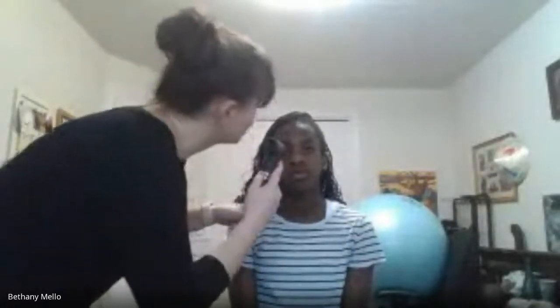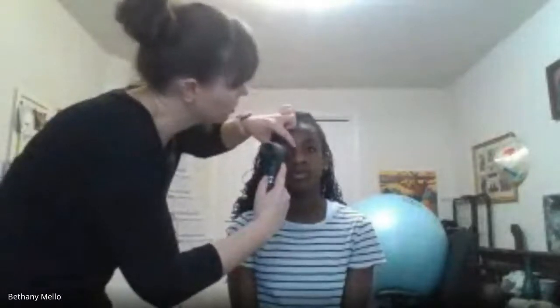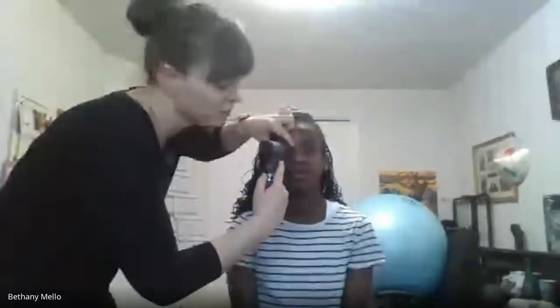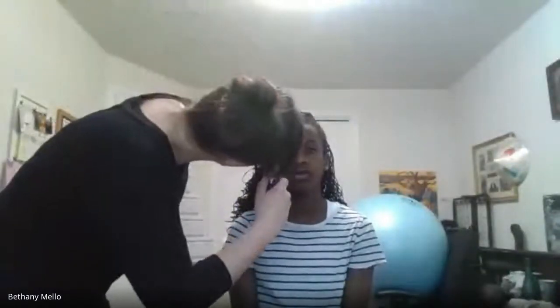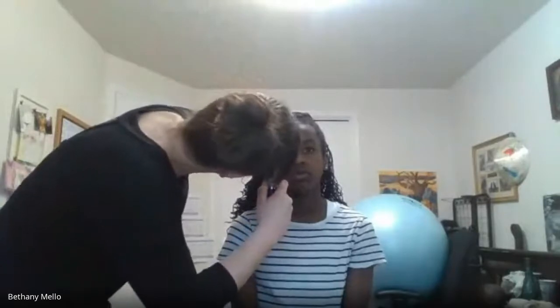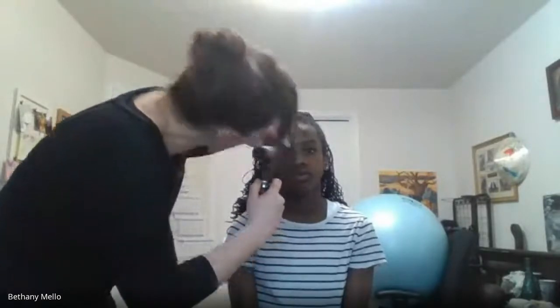And I find that red reflex, follow it in, and when I get really close here, this is where I actually take my eye off of this, make sure I'm not poking her in the eye, and I'd stick the suction around her eye and make sure it's well sealed. Then I'd look back in here, adjust anything I needed to adjust, and I try to look and find that optic disc, which I didn't see. Okay.